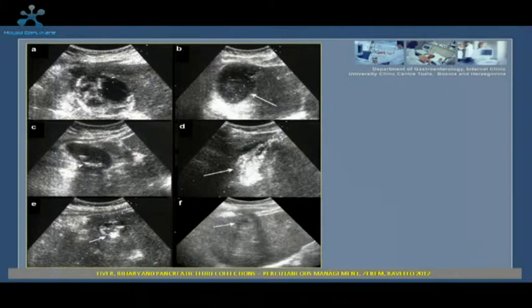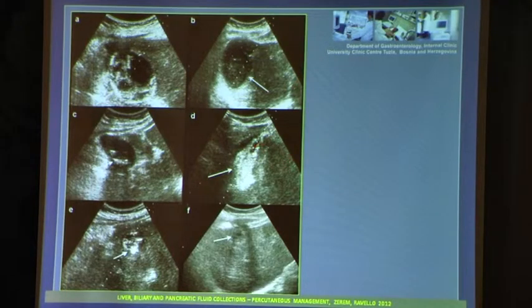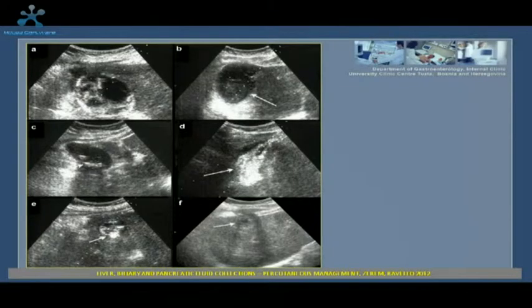Biliary calculosis could be seen after partial evacuation of the pus and necrotic content. After evacuation of the pus was completed, vigorous irrigation with antiseptic was performed, and this is the scar in the position of the gallbladder bed after 2 months, and this is the scar after 1 year.